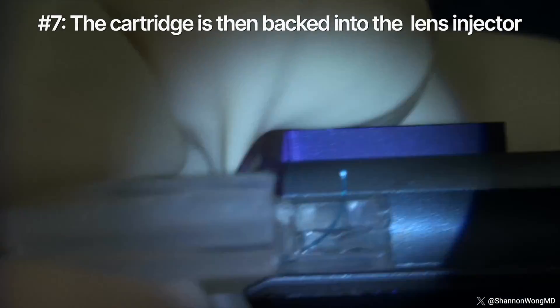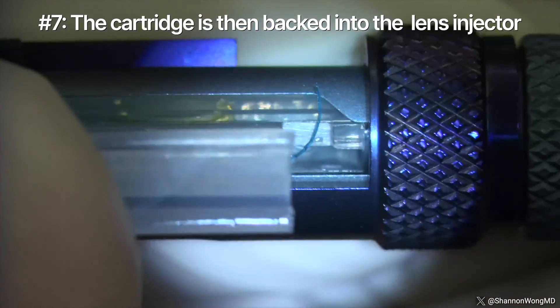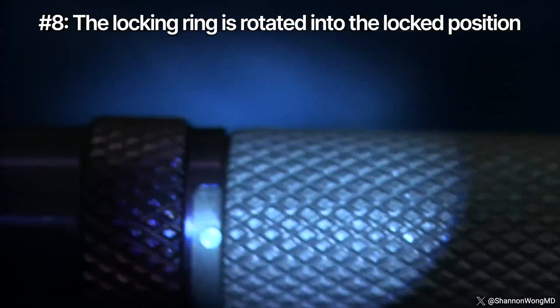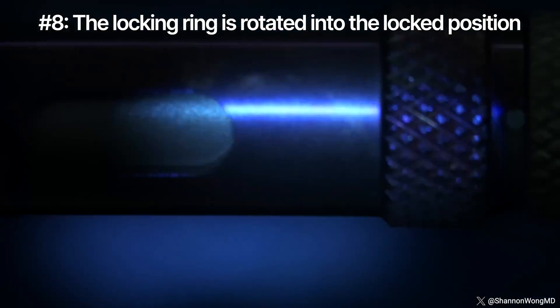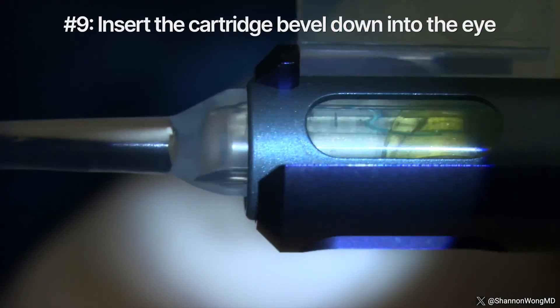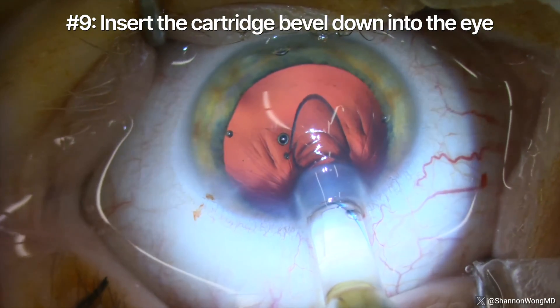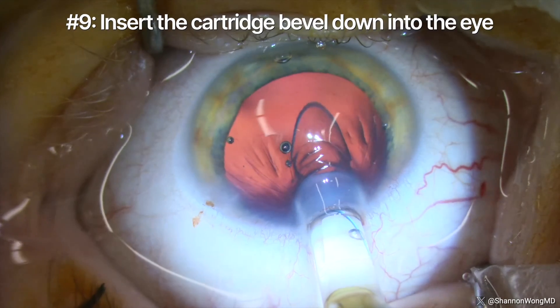Number seven: the cartridge is then backed into the lens inserter until it meets resistance and cannot be advanced further. Number eight: the locking ring is then rotated fully to lock the cartridge into a secure position. Number nine: for lens insertion, we insert the cartridge beveled down through our 2.8 millimeter incision.